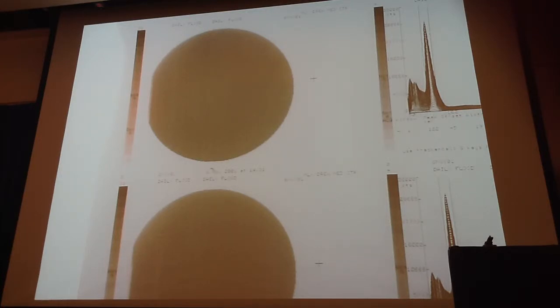But the thing that people don't like about it is that it's not the radionuclide that you're using to image patients with. So that's one of the big disadvantages. Plus, every 6 months you have to do a wipe test on it. I would bet that if I went there as a state inspector, I would find all sorts of little minor violations like that. Like, what is the serial number of your cobalt sources? When was the last time you inventoried them? When was the last time you did a wipe test on them? The radioactivity does leach out through the plastic, so you've got to keep that in mind.